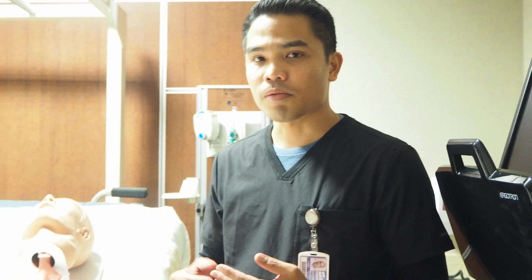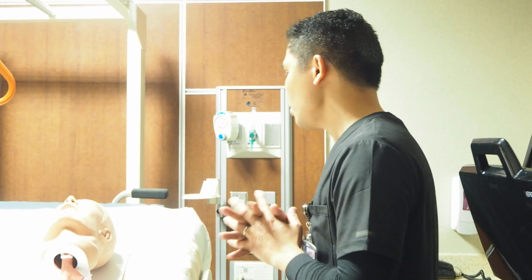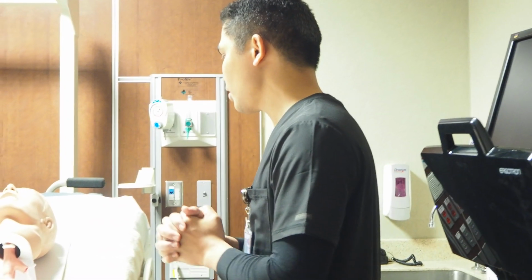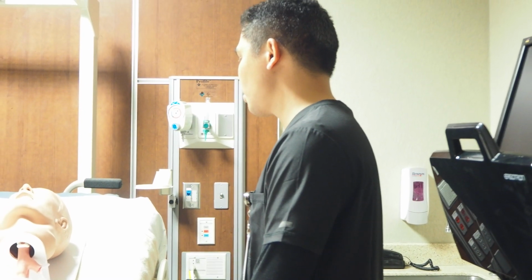Hi, so right now I'm here to perform oxygen scenarios. So I've been called in an ER, where there's a patient that needs to be hooked up with an oxygen device. So first, I'm going to introduce myself. Hi Mr. Smith, my name is Anthony and I'm a respiratory care student from the respiratory department.